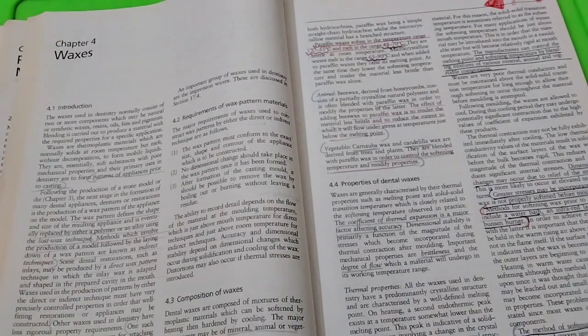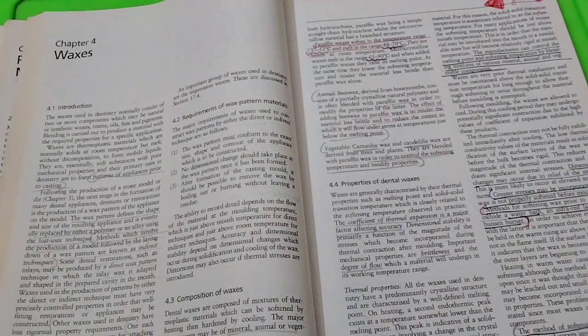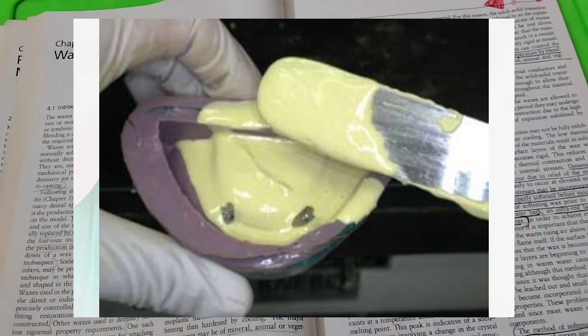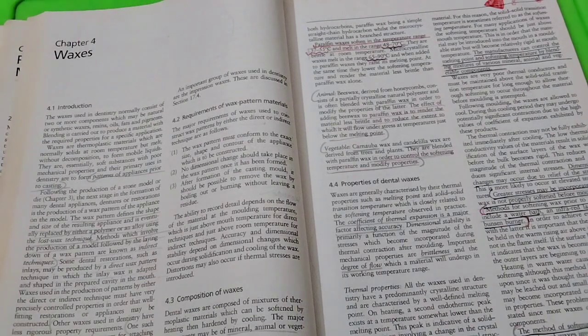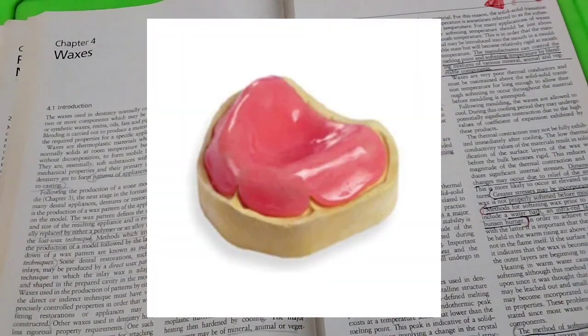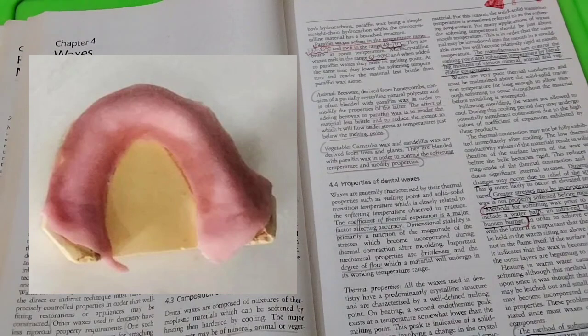We are discussing the case that we have discussed. We are done with impression, model pouring, and base forming. Now we are going to make the next step. We have to make base plate, and we can make it with acrylic and wax.